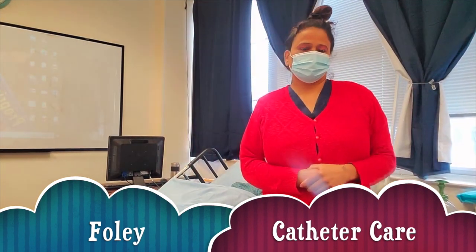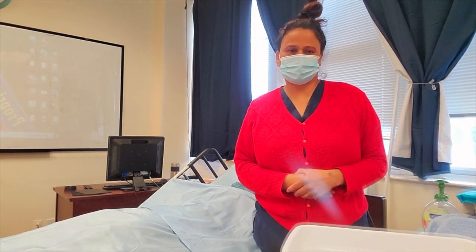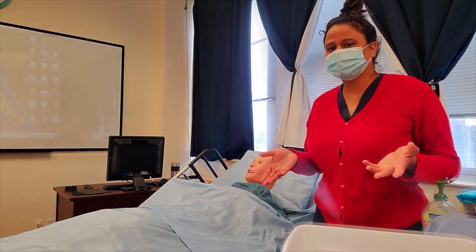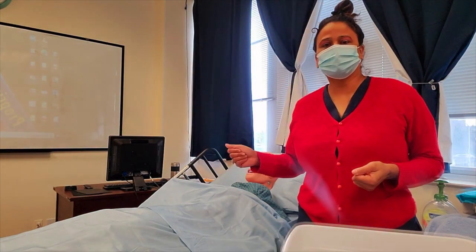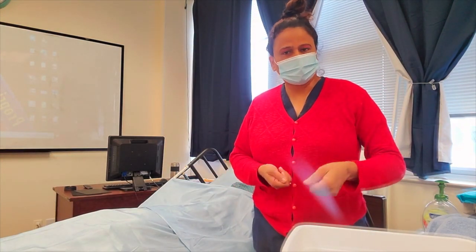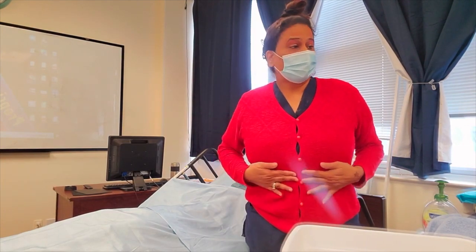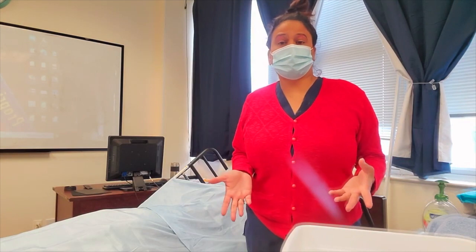Good morning, guys. Today I'm Miss Henderson and I'm going to be demonstrating to my CNA class how to clean a Foley catheter. Sometimes a patient is unable to void on their own, so the nurse or doctor inserts a Foley catheter so they can empty their bladder. If you're not able to urinate, your stomach gets distended and you get pain, so patients have what you call urinary retention.